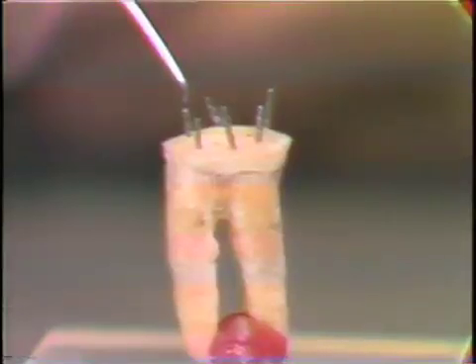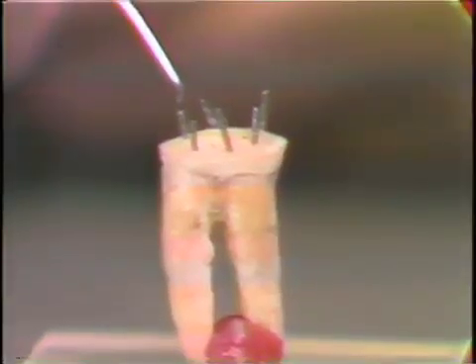into position. It's obviously critical that the position of these pins should not be close to the pulp, nor should it be too close to the outside, lest it break through into the periodontium. They are cut to a depth of 1.5 to 2.5 millimeters according to location. The pins are pushed in position, and in the molar preparation here we've got 1, 2, 3, 4, 5, 6 pins. In a smaller tooth, a smaller number of pins would be used.